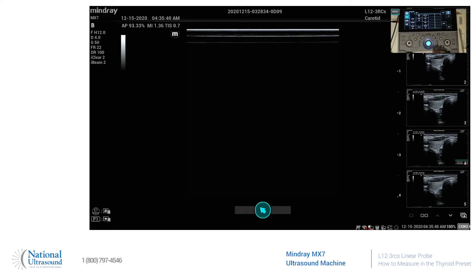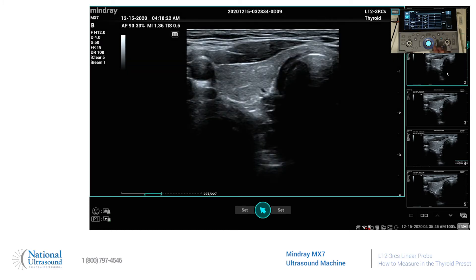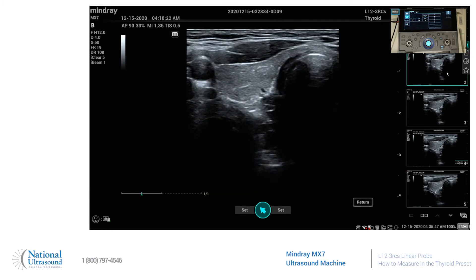I've already taken a couple images. We'll go over here and bring one of the images up. The measure key on this is right up here above the trackball. We'll hit measure and then your different calculation packages are going to come up here on the touch screen.